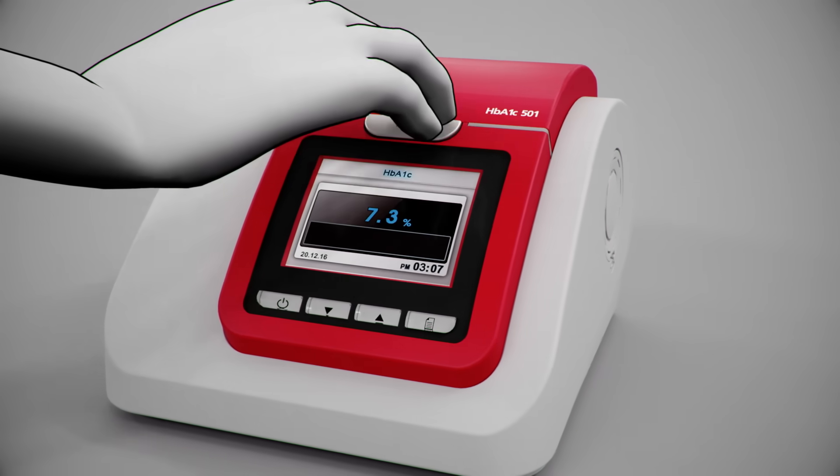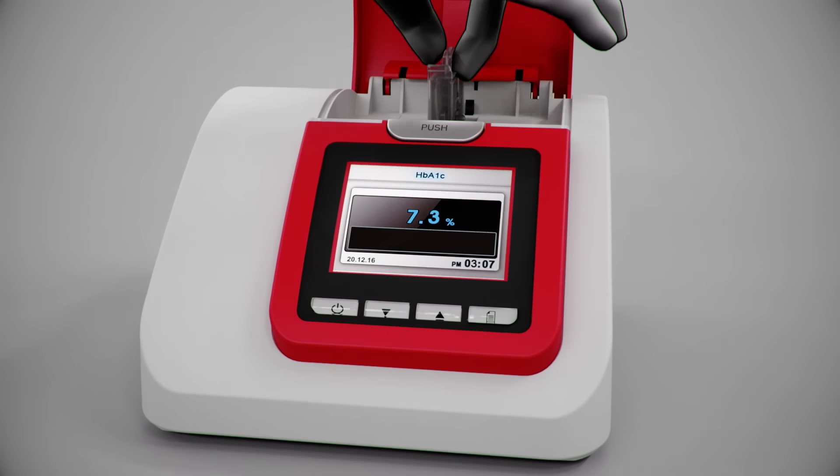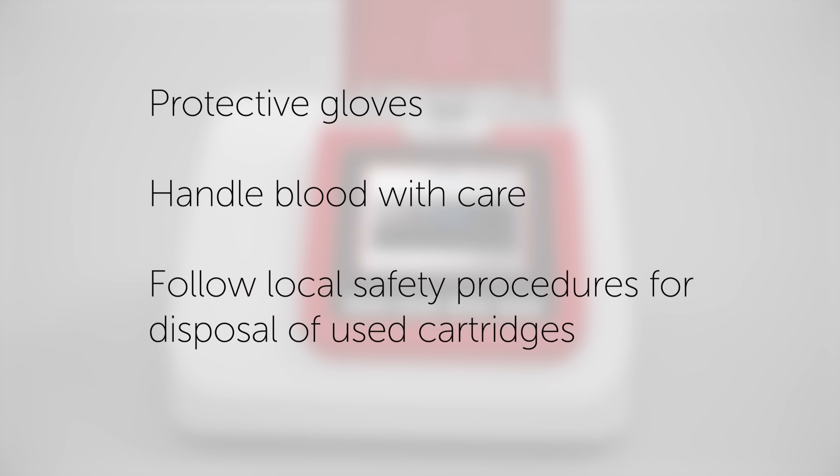Remove the cartridge after the test is completed by gently pushing it to the left and pulling it out. For your own safety, please remember to wear protective gloves. Handle blood with care, and follow local safety procedures for disposal of used cartridges.